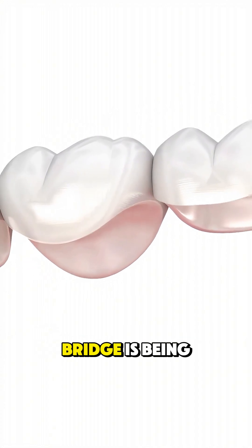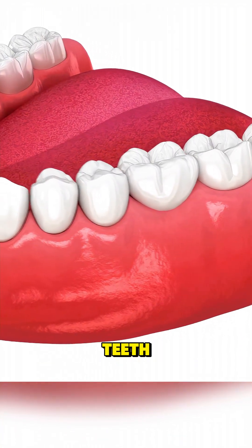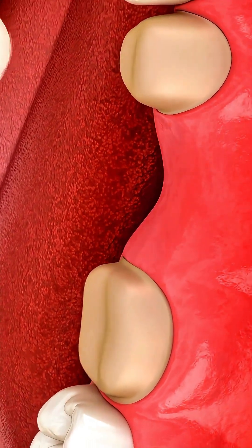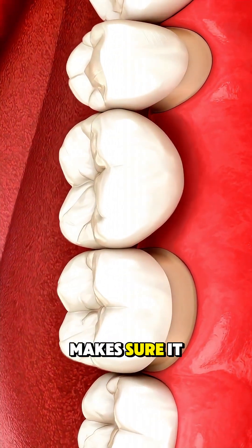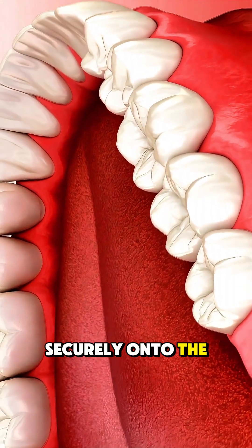While the permanent bridge is being made, a temporary one is placed to protect the shaped teeth. Once the final bridge is ready, you come back for a fitting. The dentist checks the bite, makes sure it feels natural, and then cements the bridge securely onto the prepared teeth.